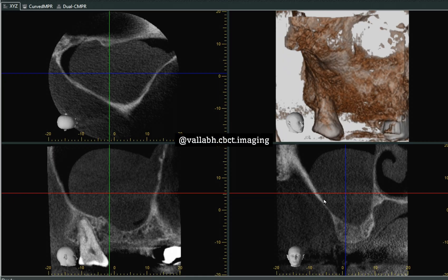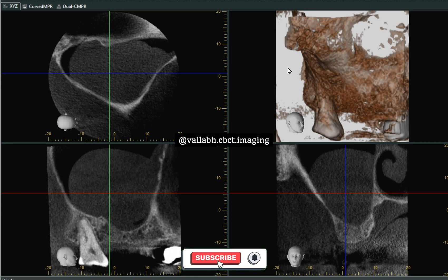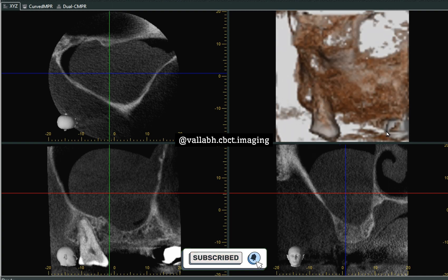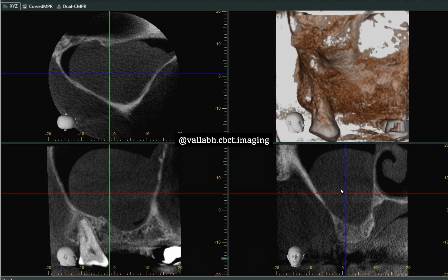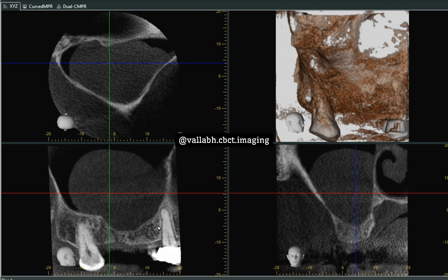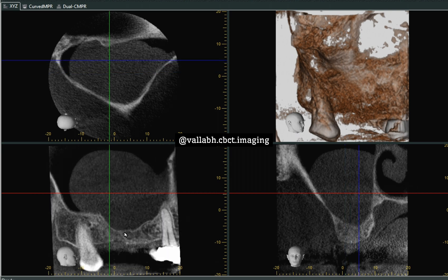Hello everyone, my name is Dr. Vallabh Chawla and today we will be doing a case report on antral mucus retention cysts. The patient came with a chief complaint of missing teeth and wanted to get an implant done, so the doctor referred for a CBCT scan for the edentulous area, and the antral mucus retention cyst or antral mucosal was an incidental finding seen in the radiograph.